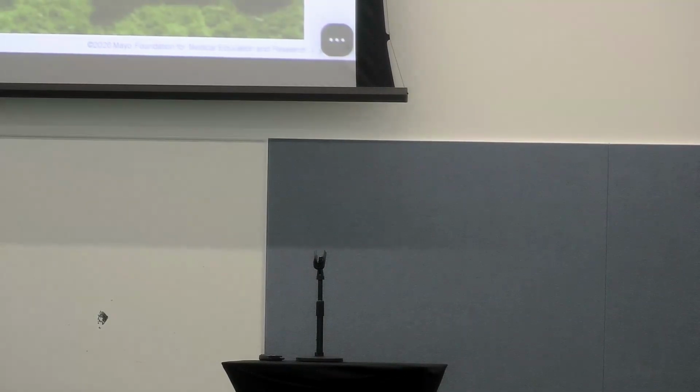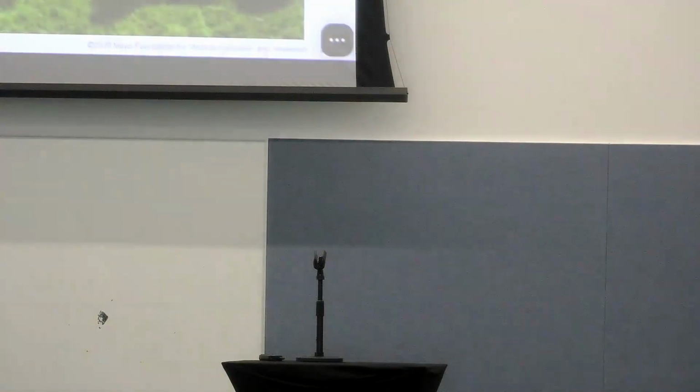I have a question about MRI. I feel like a lot of the cases that we have trouble with or misdiagnoses begin with an MRI. Can you explain why you seem to be seeing that? Sorry, so MRI, you mean in regards to ATTR versus AL, or just in general?